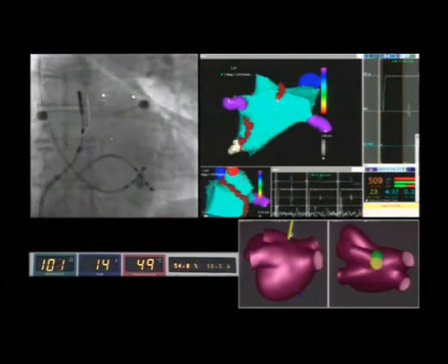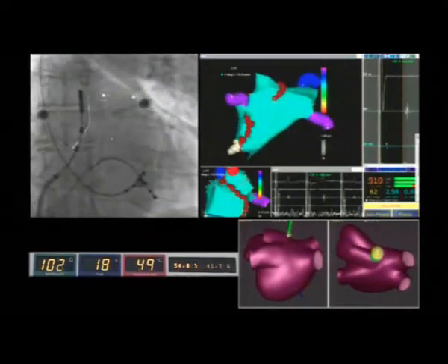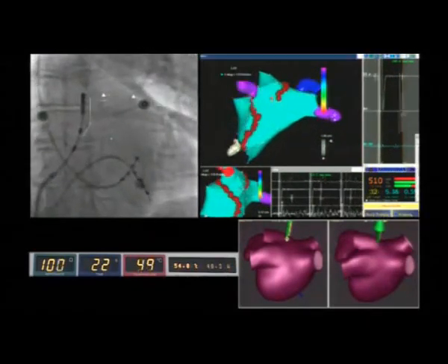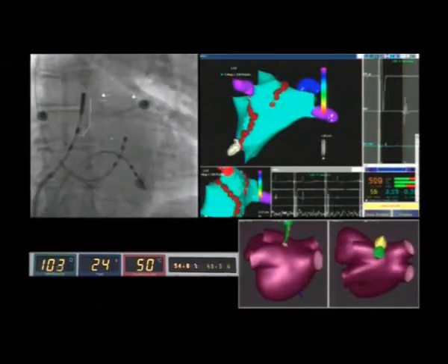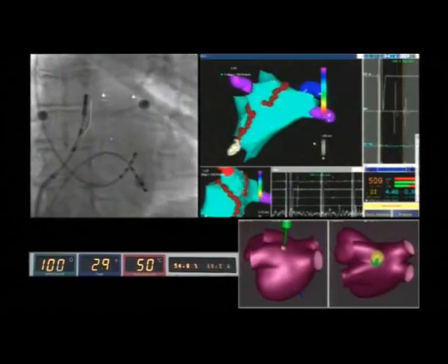The operator is now completing the circumferential lesions around the left pulmonary veins, and the line is being joined to the line of the mitral isthmus.